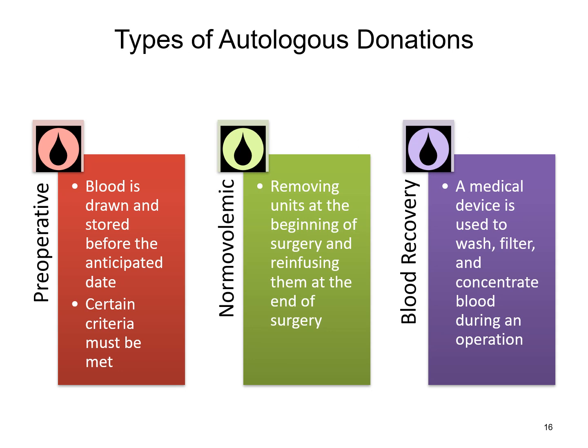So you have that preoperative donation, where the donor can actually go in and donate blood to themselves leading up to a surgery or procedure or something like that. And they must meet certain criteria in order to do that. And then that blood would be specially labeled for the intended recipient, which would be the individual that donates doing that autologous donation.